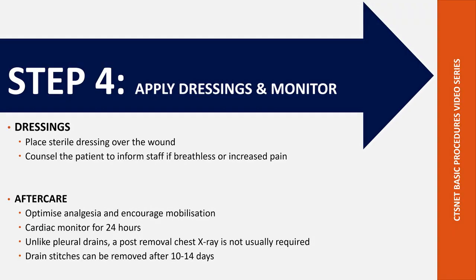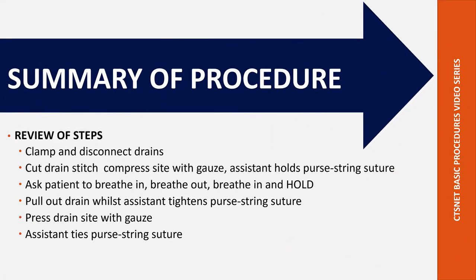Optimize analgesia and encourage mobilization. The patient should be on a cardiac monitor for 24 hours. Unlike pleural drains, a post-removal chest X-ray is not usually required, and drain stitches can be removed after 10 to 14 days. Here is a summary slide of the steps of the procedure.